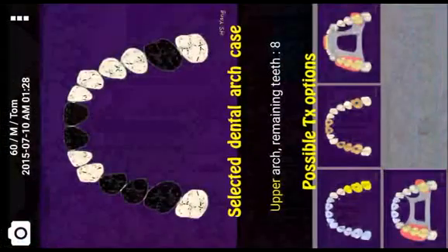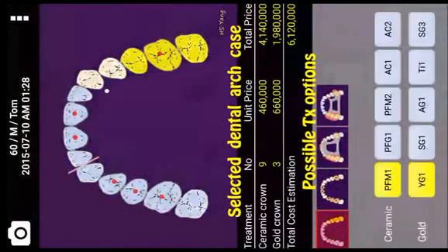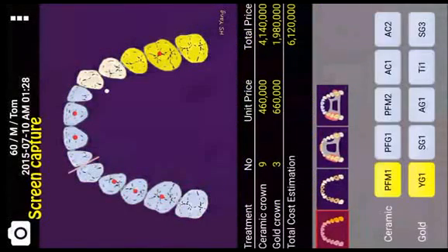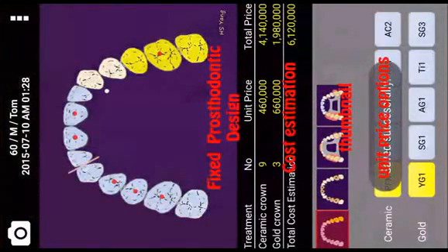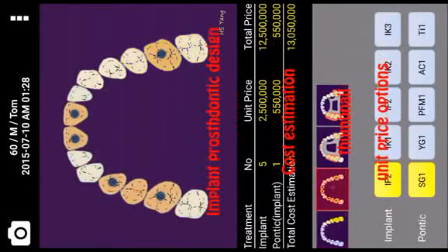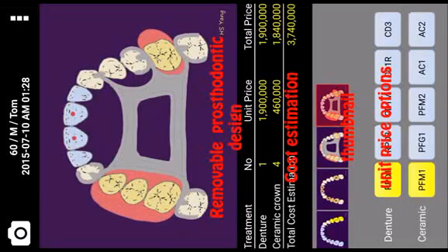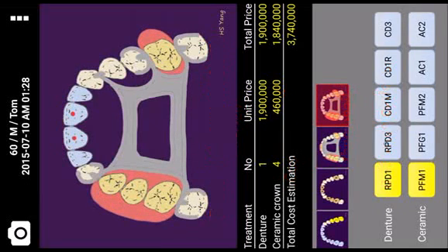The dental arch and corresponding possible treatment options will appear. The camera icon captures the screen. Different colors show the different types of dental restoration. Prosthodontic design and total cost will be displayed.